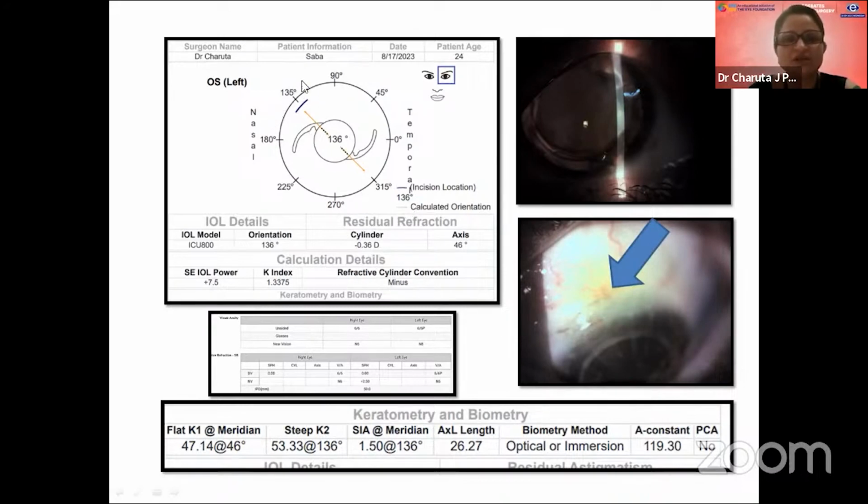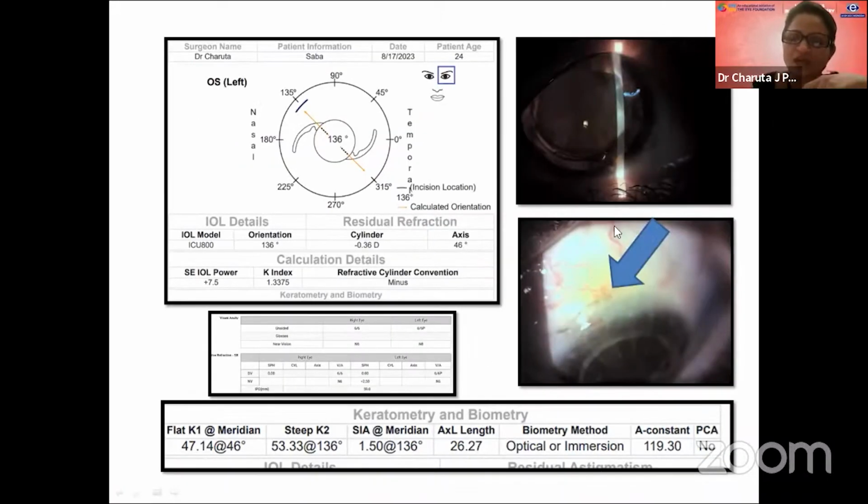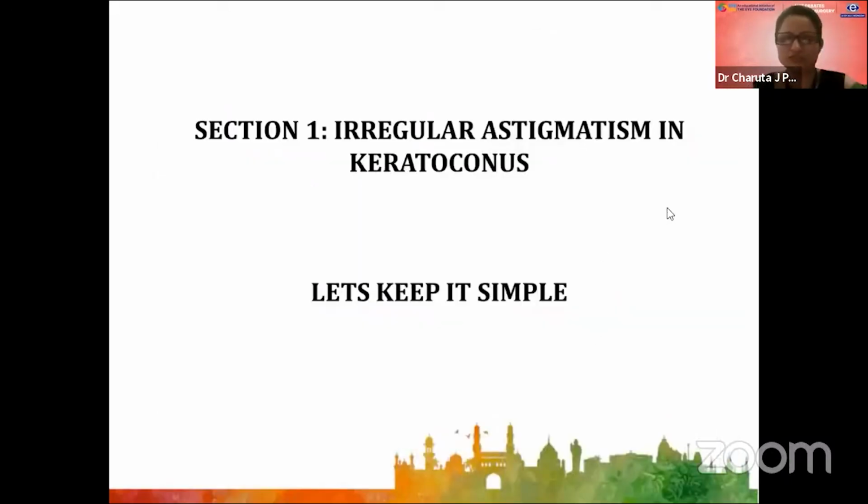I planned a sclerocorneal tunnel incision in order to create a surgeon-induced astigmatism of 1.5. And then at the end, this is her last follow-up. You can see there is a piggyback IOL of the toric IOL along with a sphere of +2. So altogether, post-op day 1, she was 6/9, and now 1 month post-op, she's 6/6 partial. I'll come back to this case later on. This is to say that the grapes are not sour.